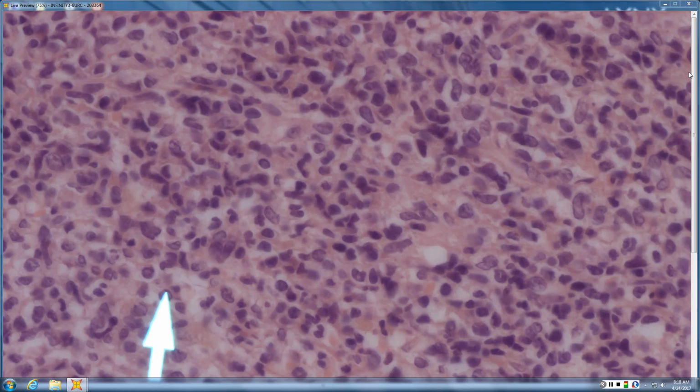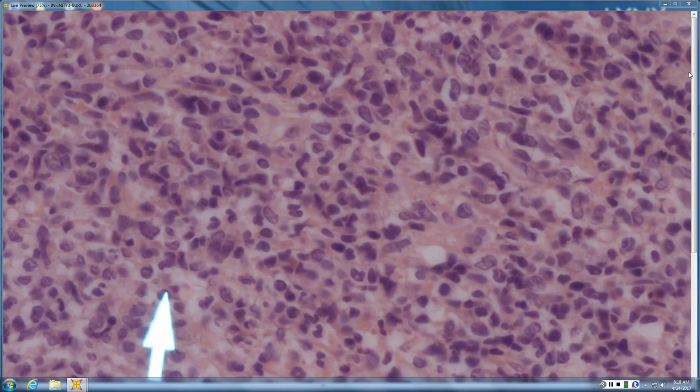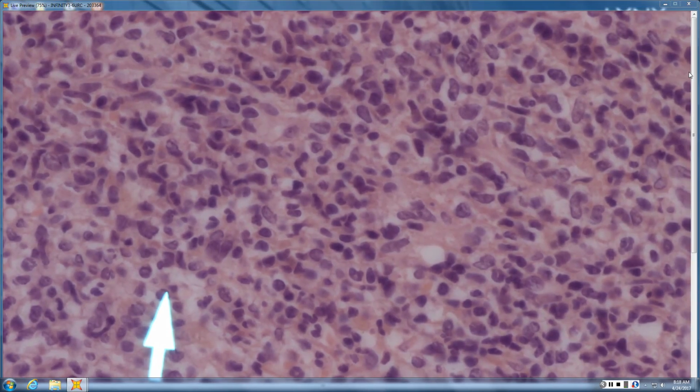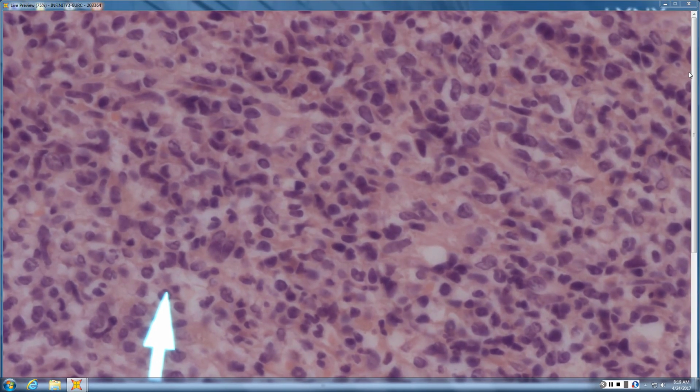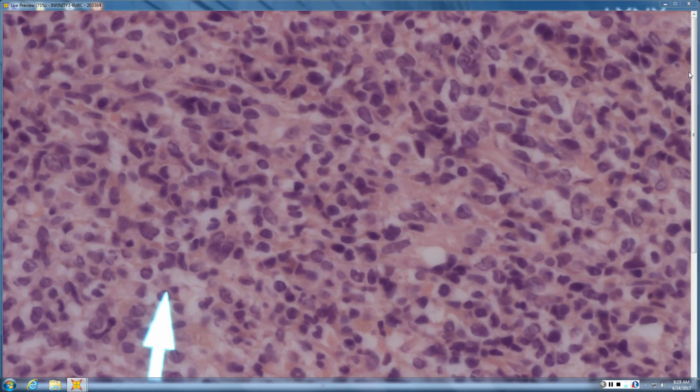One of the problems is if you just do your lymphoid markers, leukemia picks up T cell markers. So leukemias commonly stain like a T cell, but the one they don't pick up is CD3. So if you have something that's picking up T cell markers, especially CD4, but is CD3 negative, that should make you think of leukemia.